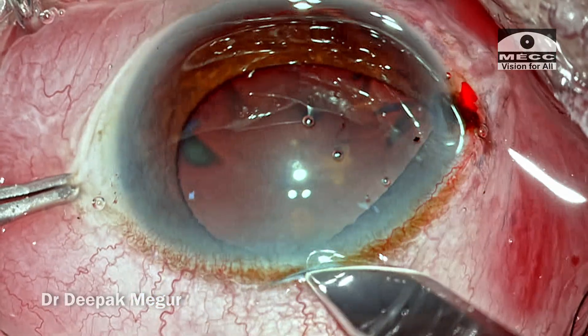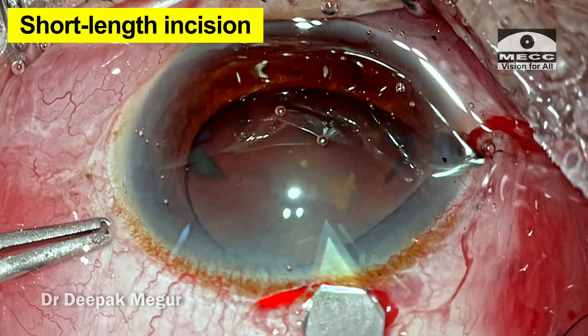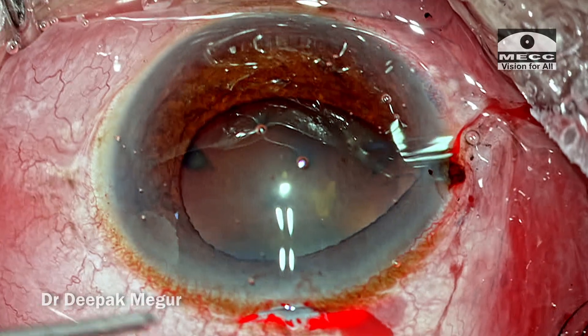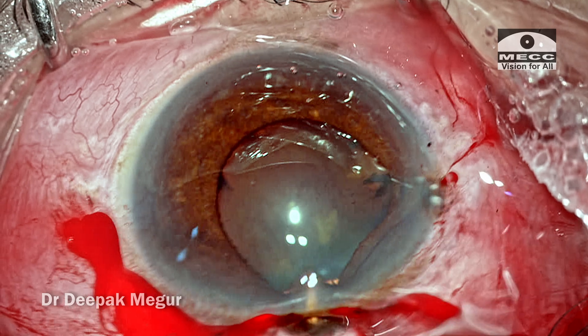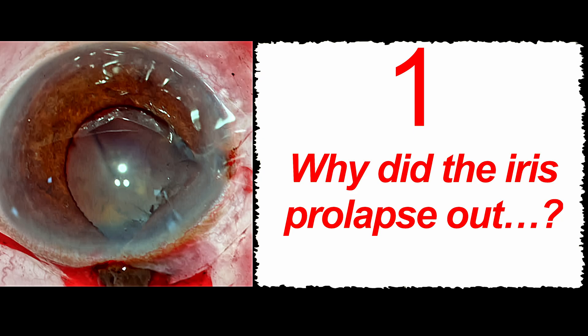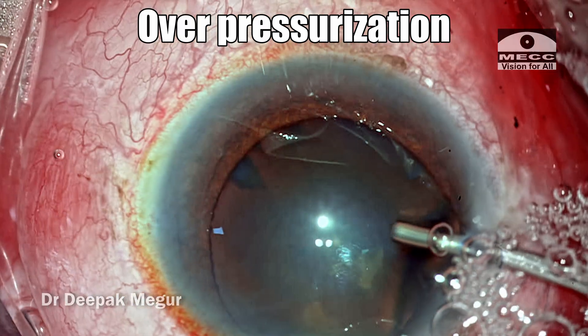To counteract, a new incision was created, which unfortunately is very short with no corneal tunnel as such. Because of this poor wound construction, the iris from the main incision is also prolapsing out. How do we deal with this situation? First, try to address the question: why is it happening? The answer is overpressurization — there is more pressure inside the eye.